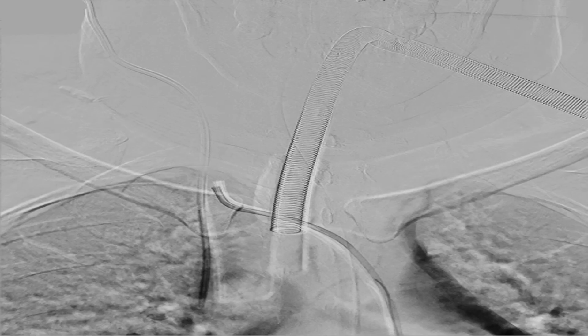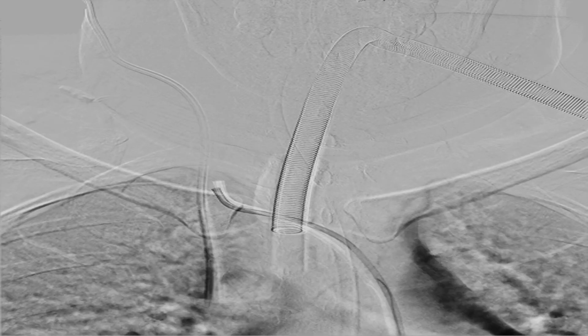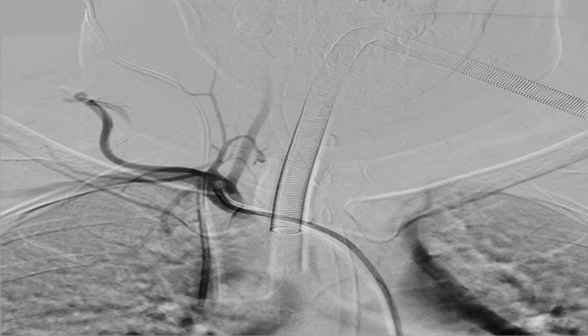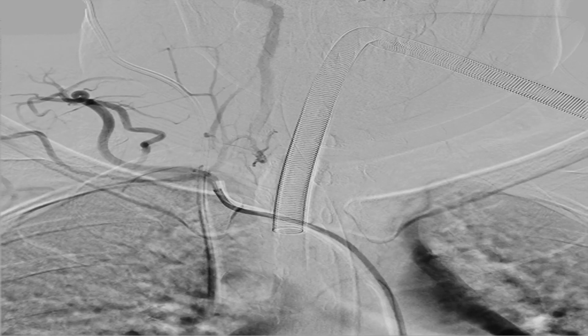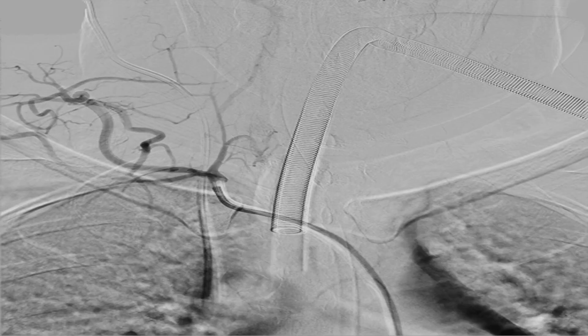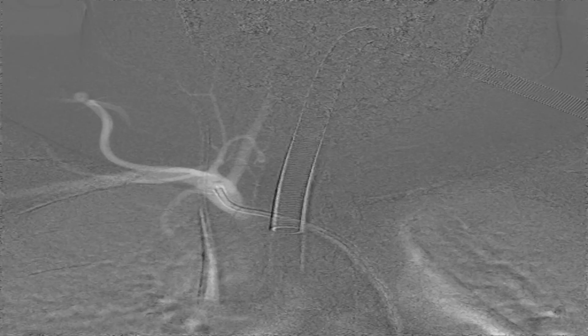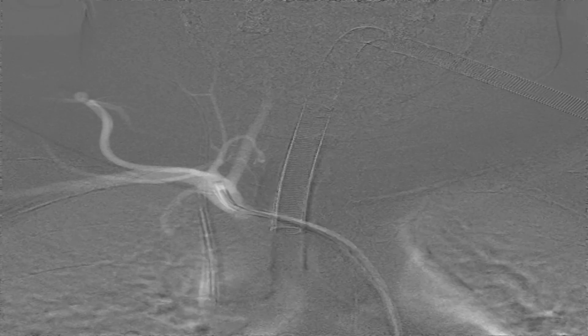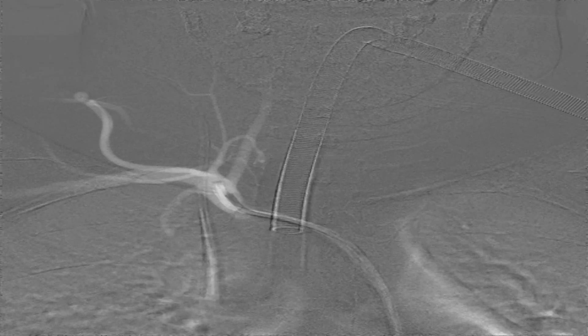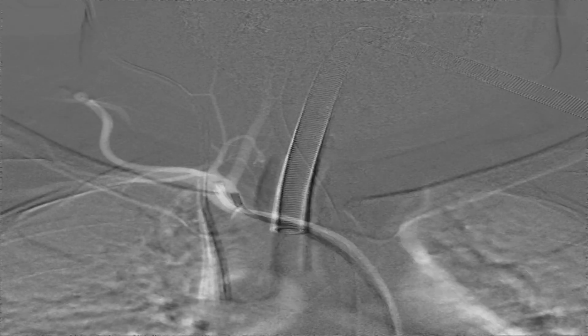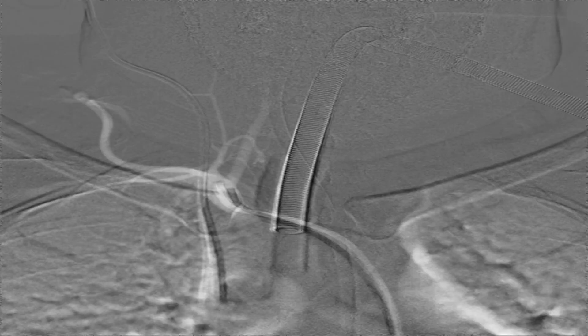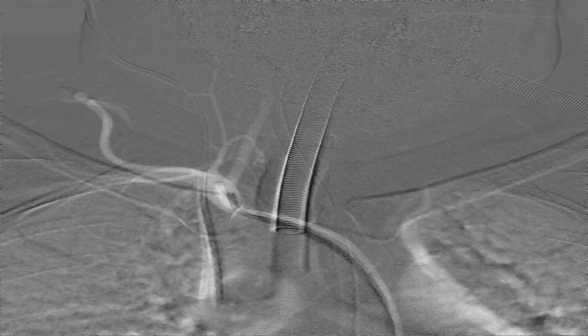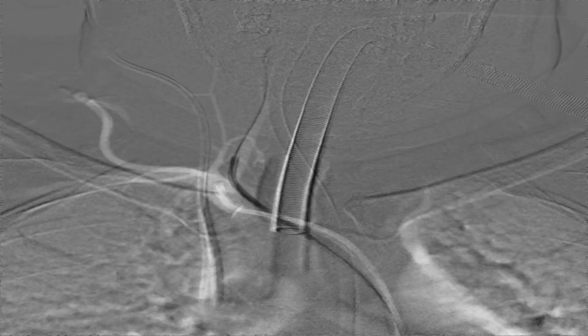For right vertebral artery catheterization, we withdraw our catheter into the brachiocephalic trunk and take a DSA of the brachiocephalic trunk. We then advance the wire into the right vertebral artery and pass the catheter over it. We do not need to advance the catheter beyond its opening for diagnostic DSA. From the opening, we take a biplane DSA of the vertebral artery.